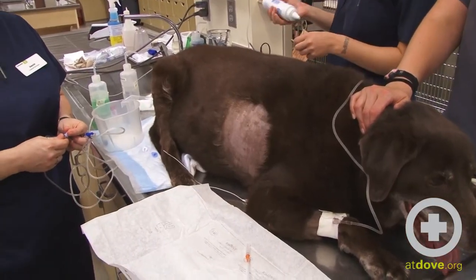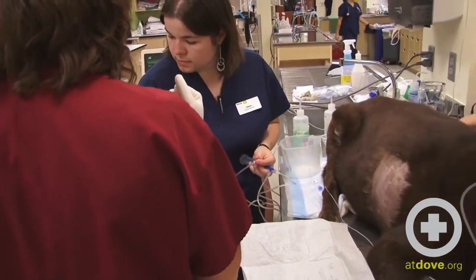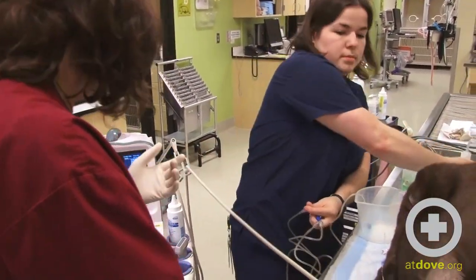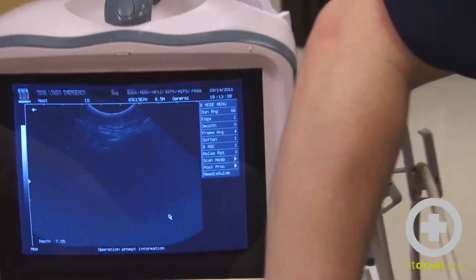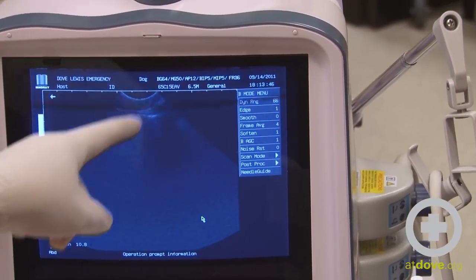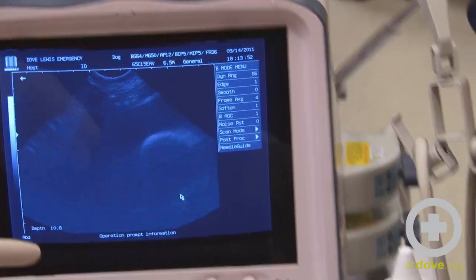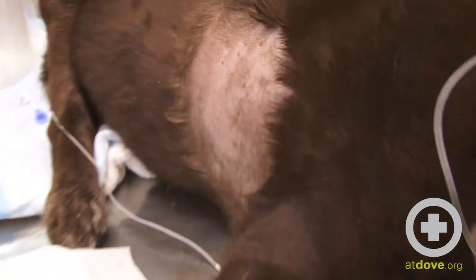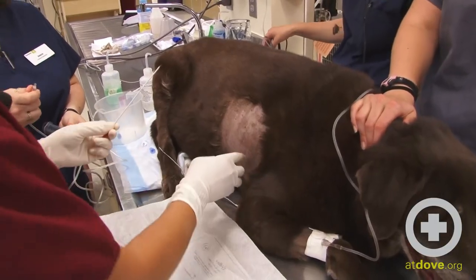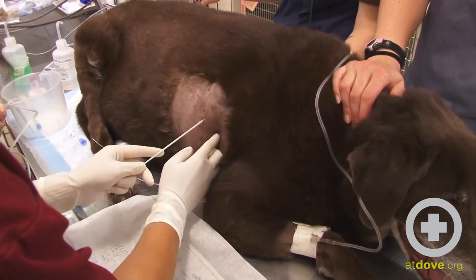In this procedure when you use ultrasound guidance you will have a clean hand and a dirty hand. I'm left-handed, so my right hand is going to be my dirty hand, where I'm going to look for the most obvious window for the effusion. You can see here — here's the heart, there's the pericardial effusion, there's the body wall. So we're going to go pretty much right there. Go to the cranial aspect of the rib to avoid the intercostal vessels and nerves that come off the caudal aspect, and basically just go straight in.